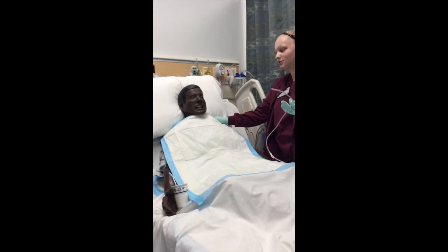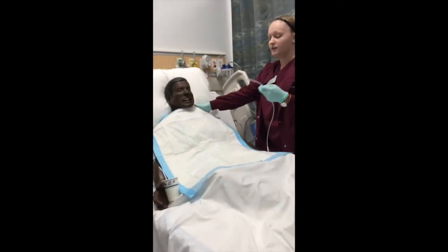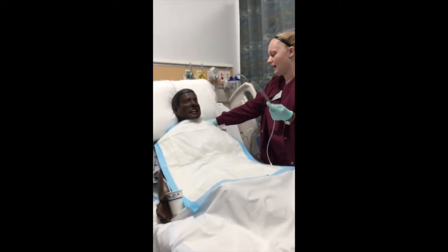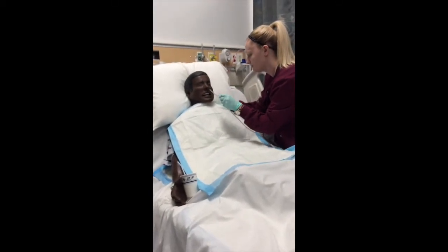So I'm going to have them demonstrate tucking and swallowing for me. That way I make sure that they understand the procedure. So after they've done that, I'm going to say, okay, I'm going to start. Just go ahead and take a deep breath for me. In, out, and then in and hold it. I'm going to start inserting.